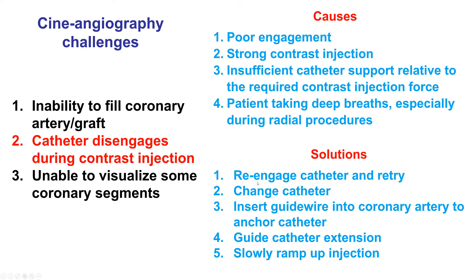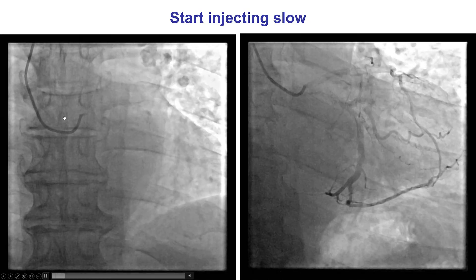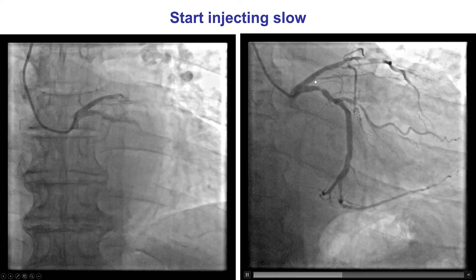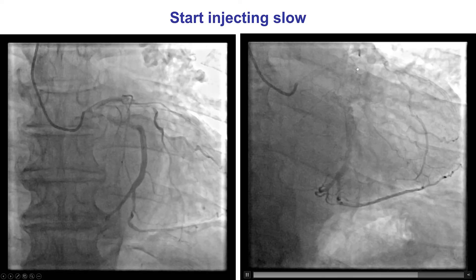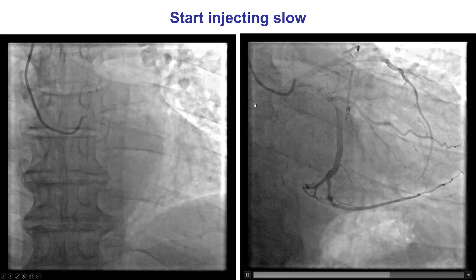How to fix catheter disengagement? Re-engaging using different catheters. Sometimes putting a guidewire can stabilize the catheter and enable good angiography, or a guide extension can be used. When injecting, it is important to start slowly and then increase the pressure as time goes by. This is an example in which forceful injection from the beginning pushes the catheter out, but with the same catheter and a slow ramp-up of pressure, good filling of the coronary artery and the ostium can be achieved without the catheter kicking back.